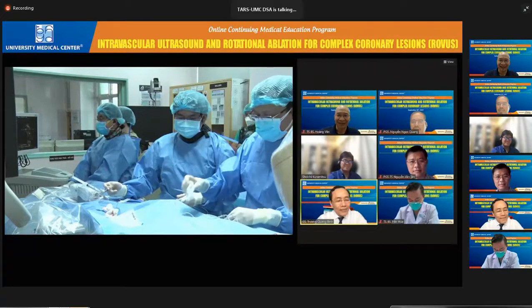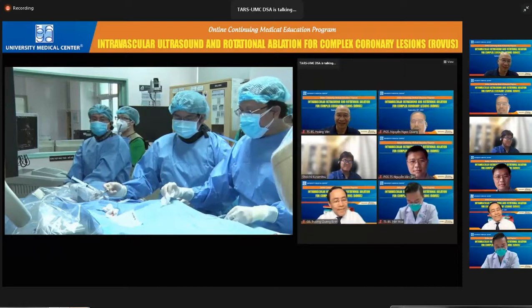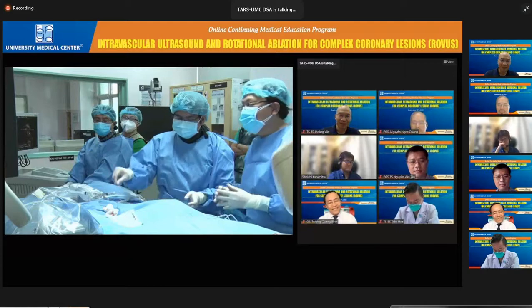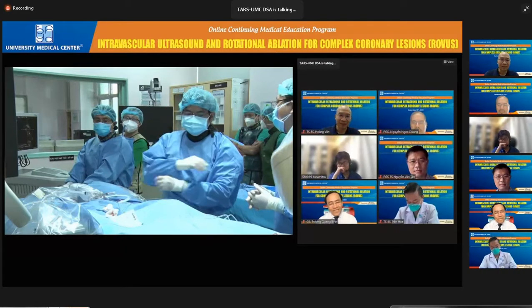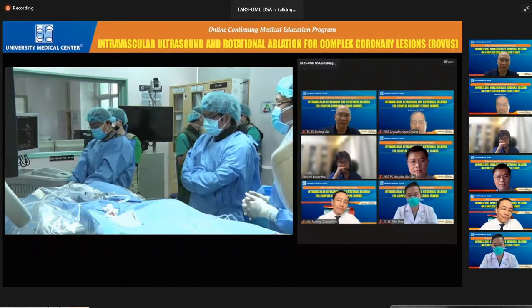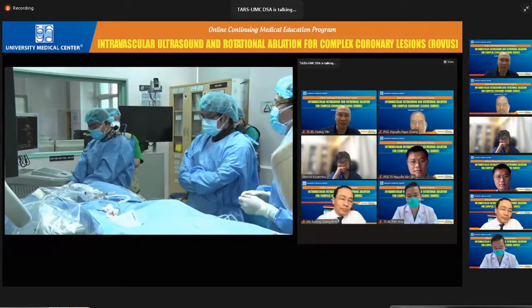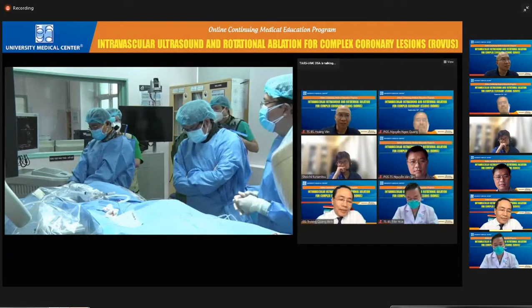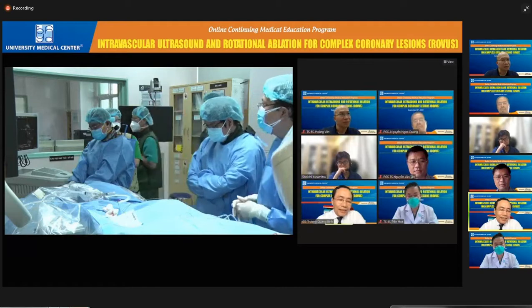Yeah. I have one more question before I start the procedure. We have the EBC-MAIN trial about the provisional stent. What do you think about the EBC-MAIN trial? Can we apply this trial in this case or not? I would like some comments from the panelists.